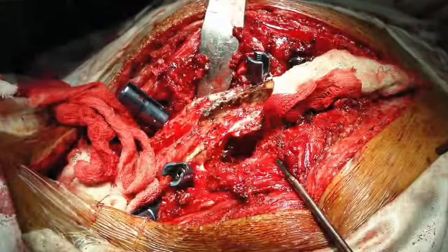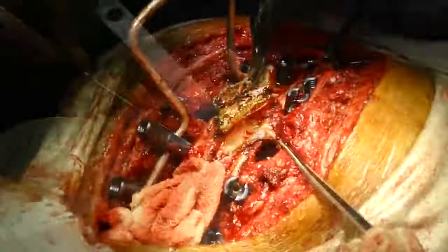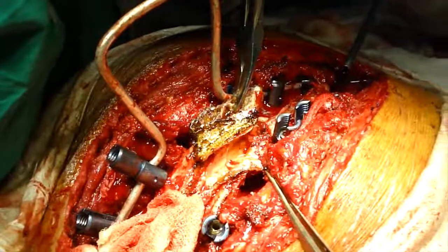An omega-shaped working rod was locked into the screws to facilitate two surgeons operating simultaneously. Then the free-floating spinous processes were gently dissected off the dural sac. There were no adhesions and it could be removed easily.